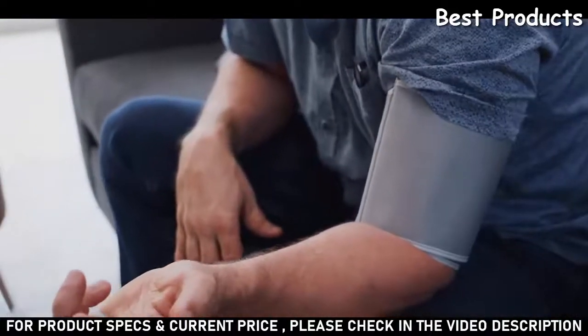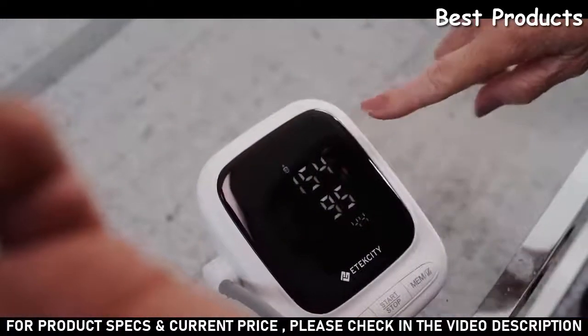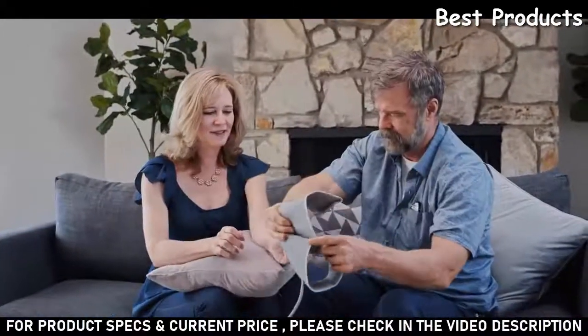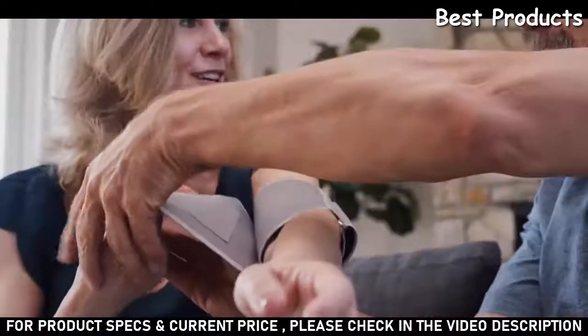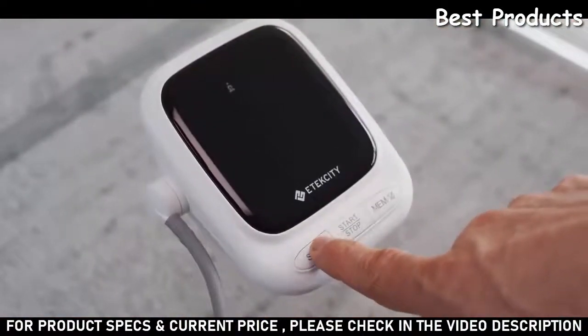When measuring is done, your blood pressure and pulse can be easily read on the clear and crisp LED display. The EBP UA5 has a powerful memory function that allows two users to store up to 90 results each. Your results are automatically saved after each test. Press the Set User button to cycle between the two users.